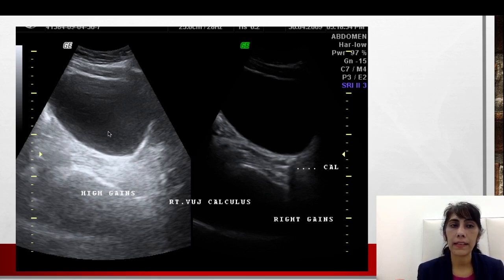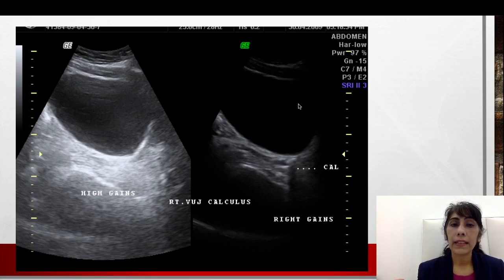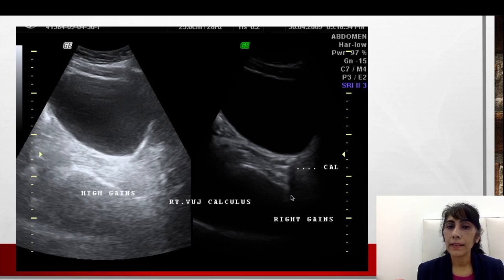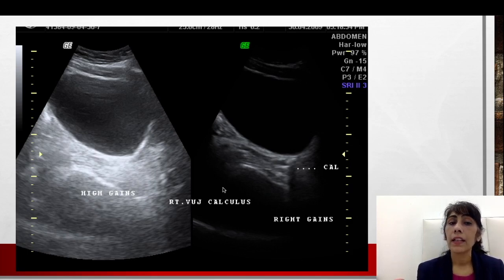These are two pictures of the same patient who came with mild lower abdominal pain. Nothing has changed between these two pictures — same machine, same probe — except we have changed the gains. In the first picture the bladder looks grayish, while in the second the bladder is almost black and clear as it should be. The gains are too high in the first image. Now see what blunder was created by high gains — in the high-gain image, this area looks fine. But when I reduce the gains, I see a tubular longitudinal area, a white area, and a shadow — which is a dilated ureter, a calculus, and the shadow caused by the calculus.